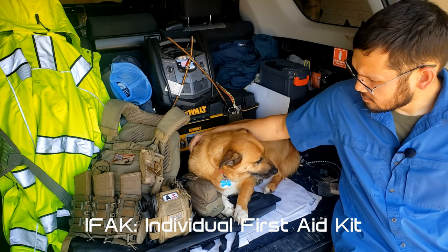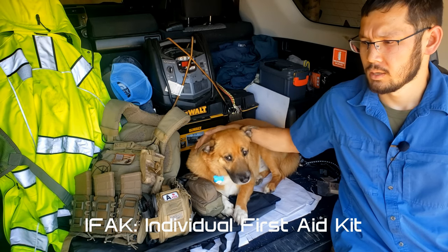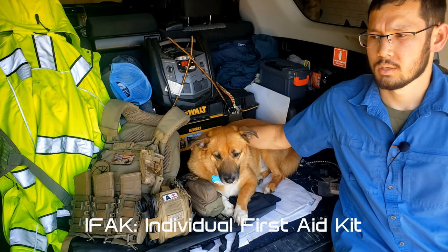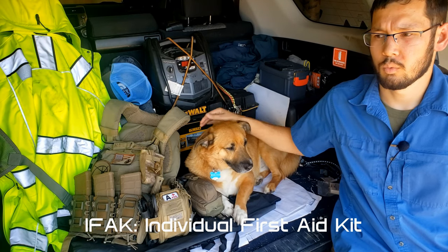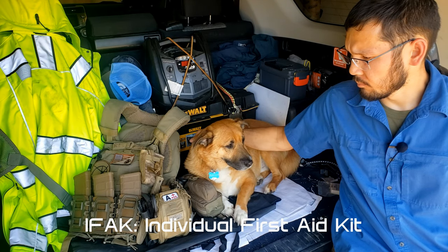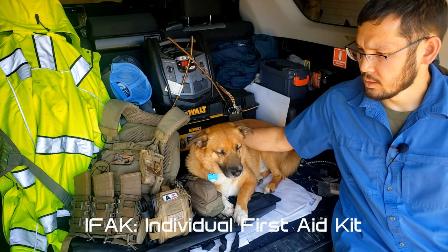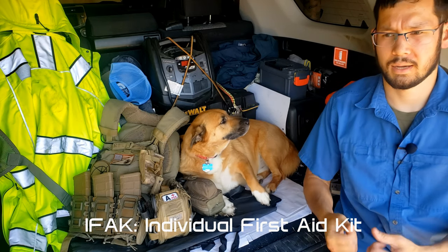So as you put together your kits, you can buy pre-made kits. North American Rescue is good. Chinook Medical is good. There's a few good companies, and we might start recommending some. Or you can make them. I've made my own kits. But you've got to keep that in mind: emergency trauma. Somebody's bleeding, your hands are covered in blood, and I've got to get to this equipment.